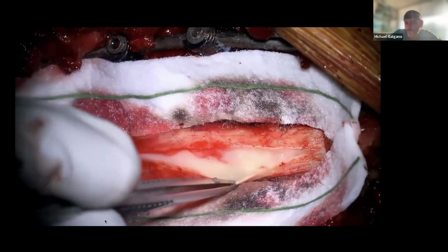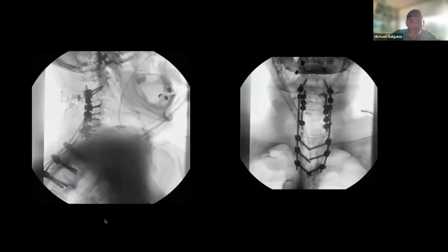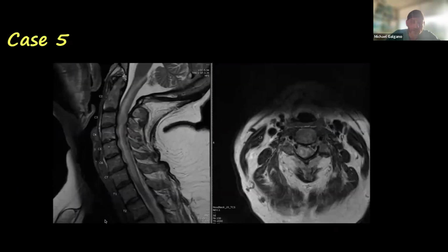But this was a great case where the radiologist helped us out tremendously, because it raised our antennas that, hey, we should probably look intradural. And I'll be honest, when I looked at the first scan, I didn't pick up on that nuance lower down. I was just thinking, oh, this is kind of a run-of-the-mill epidural abscess. So, interesting case.